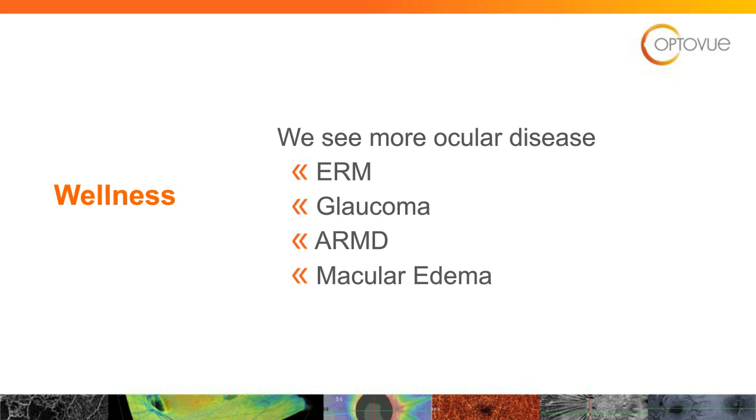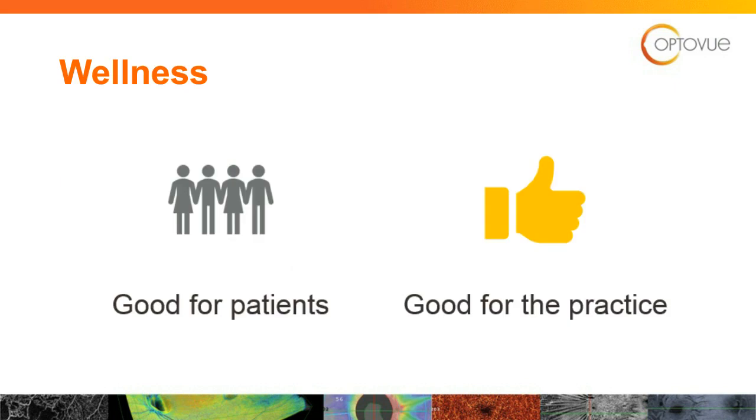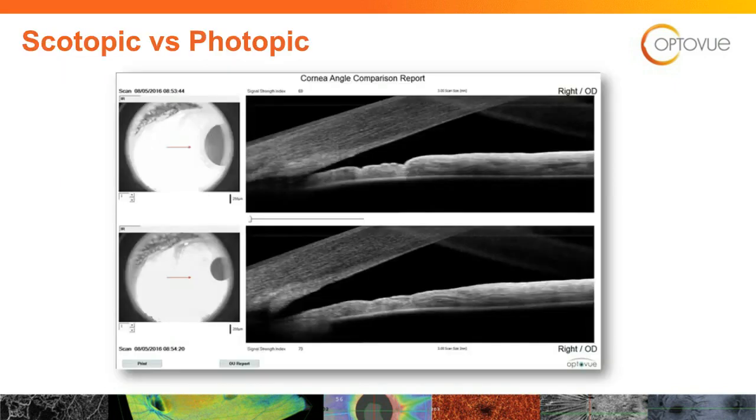So it's good for patients, good for the practice. I do want to say one word about OCT when it comes to angles. Using that high-resolution instrument to look at angles as an adjunct to your gonioscopy is amazing.